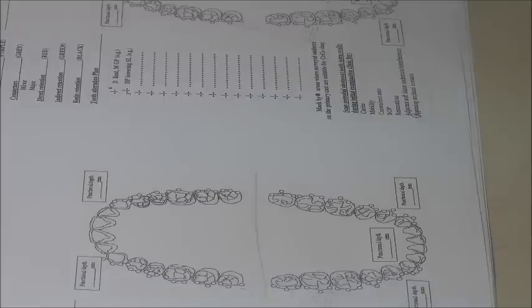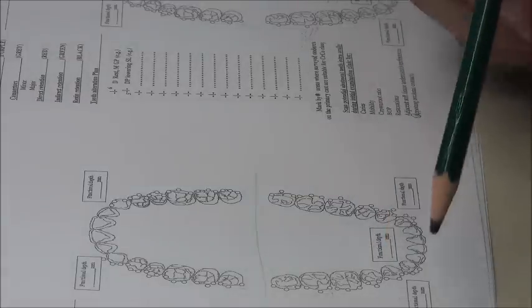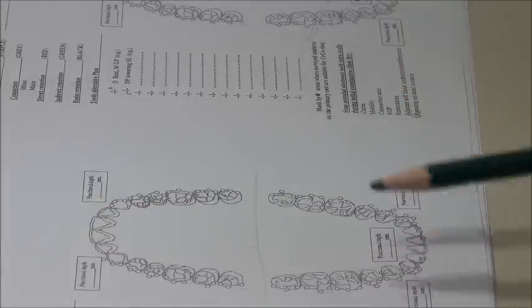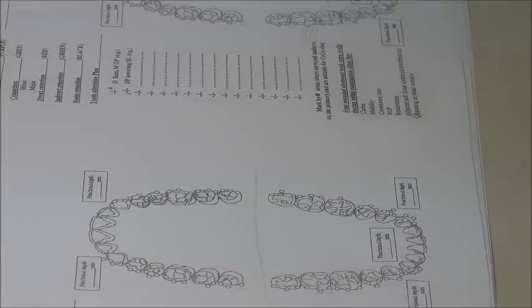Usually the freni. So I need to stretch the frenum very well, and then take the depth, if I'm going to put an I-bar there. Okay? In the lower lingual area, for selecting the major connector, I need to raise the tongue anteriorly to see the lingual sulcus depth. Okay? So this is called functional depth. Not to forget it, I put it down in the areas where we usually have our I-bars going, or gingival approaching bars altogether. Okay?